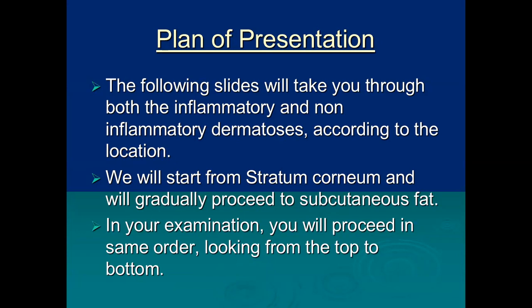You are always going to see the slide in a methodical manner from the top to bottom.